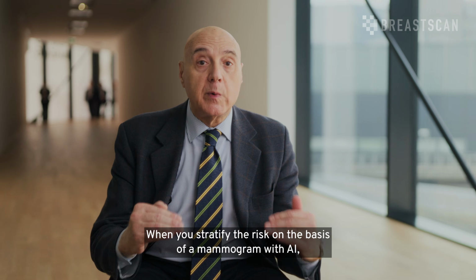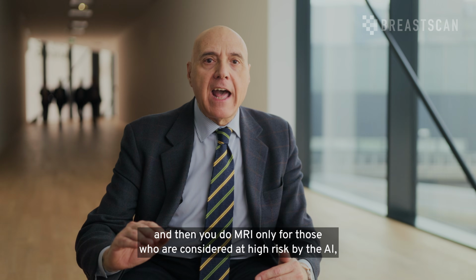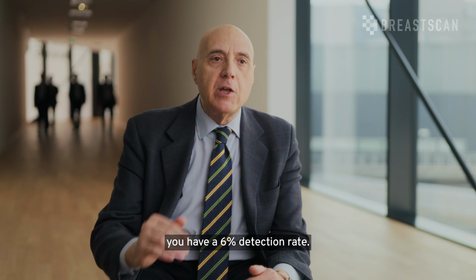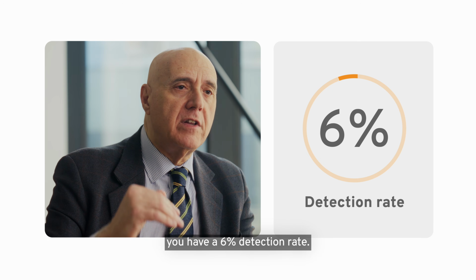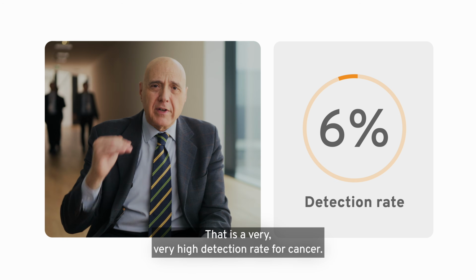When you stratify the risk on the basis of a mammogram with AI, and then you do MRI only for those that are considered high risk by the AI, you have a 6% detection rate. That is a very, very high detection of cancer.